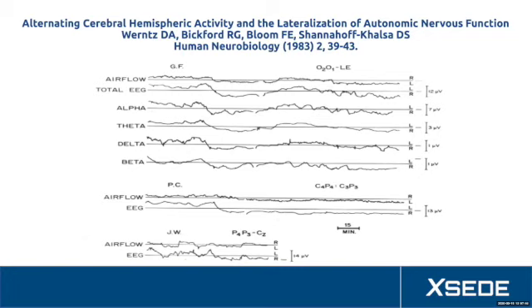We kept these people in the chair, in a relaxing chair, and asked them to do nothing, and we were just watching their natural endogenous rhythm. And below the airflow, you see total EEG, alpha, theta, delta, and beta, and you can see right offhand that they all sort of parallel each other very nicely. Subject PC below also shows, and it shows that the right nostril and left hemisphere are dominant for total power.